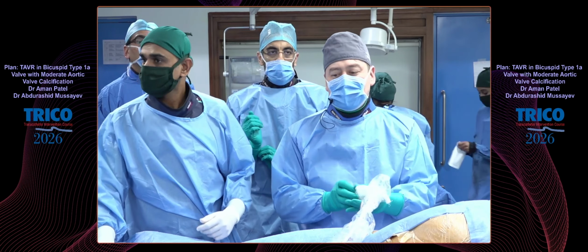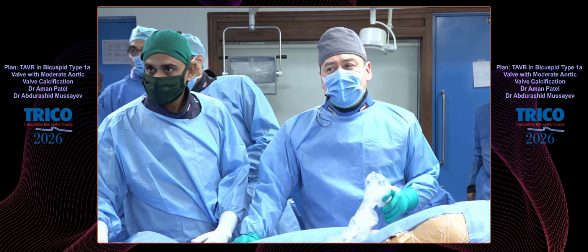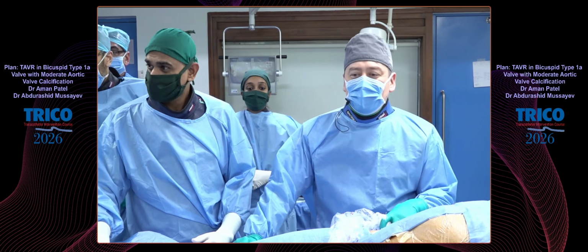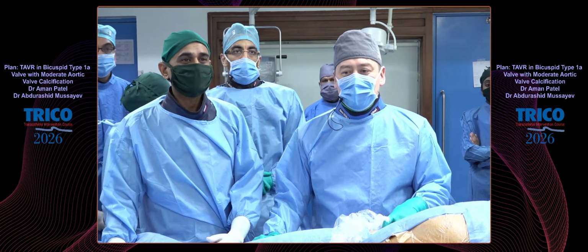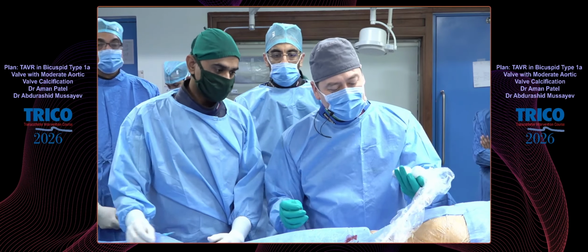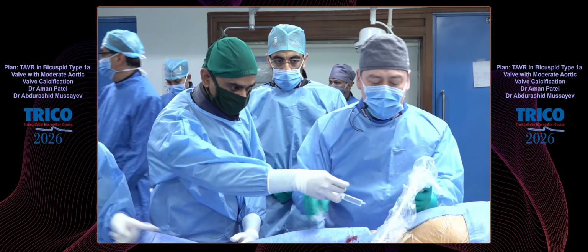As Dr. Aman mentioned, there are different techniques for femoral artery puncture. We could do cut down, we could do crossover technique, we could do ultrasound-guided puncture, and all these techniques are good. It depends on hospital protocols, but in most cases in our hospital we are using ultrasound-guided puncture.